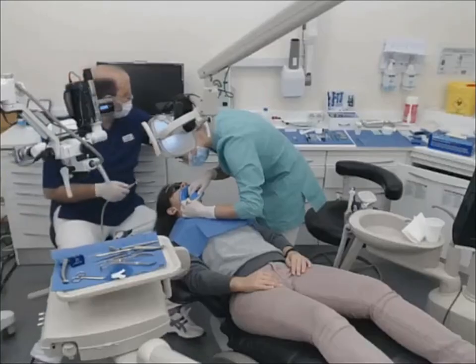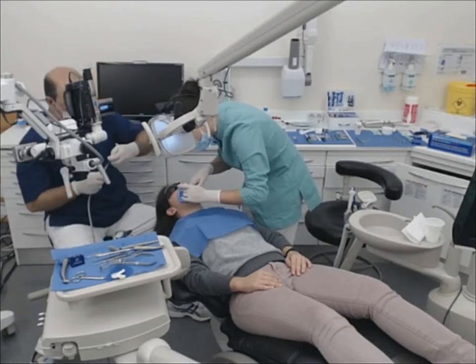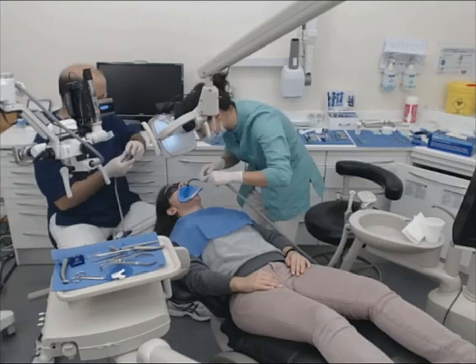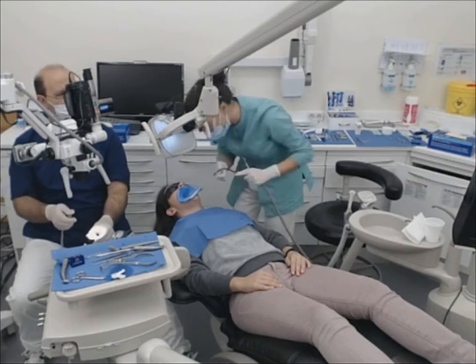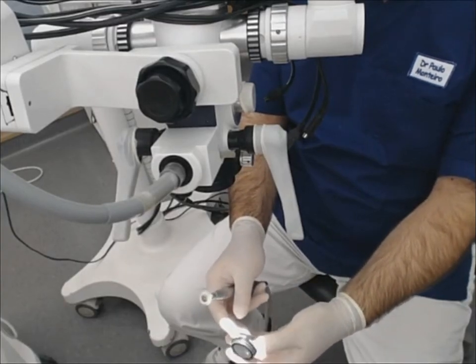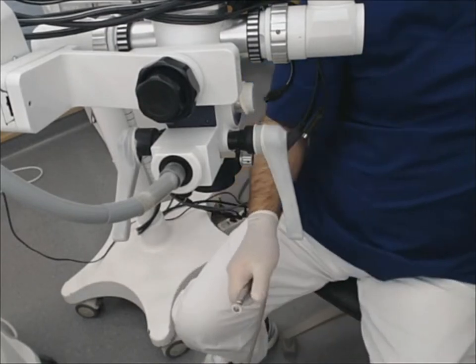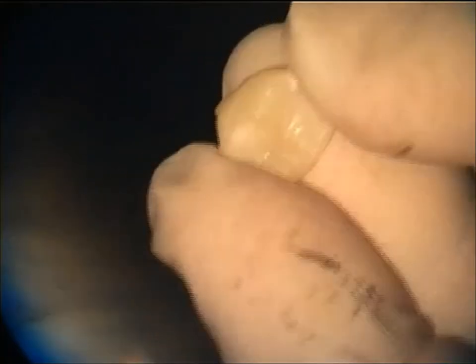Okay, now I'm gonna pass to the second polishing paste, the gray one. I just change the wheel, the disc I'm gonna work with, and then with this gray polishing paste, look, it's from Diashine, okay? Diashine from VH Technologies. So I take a little bit, and then I'm gonna pass on the overlay.